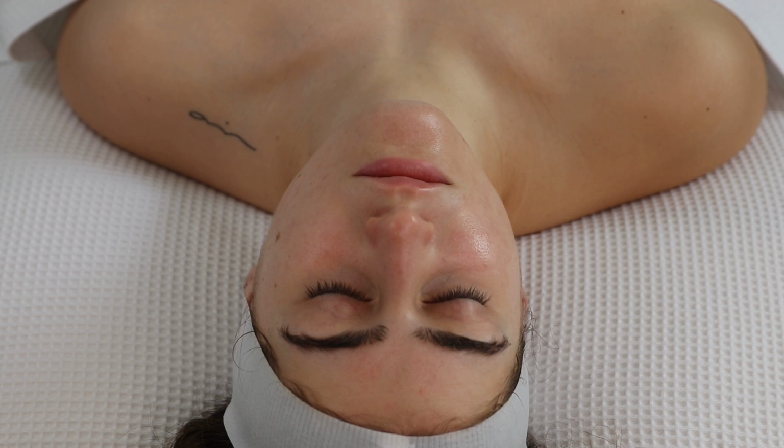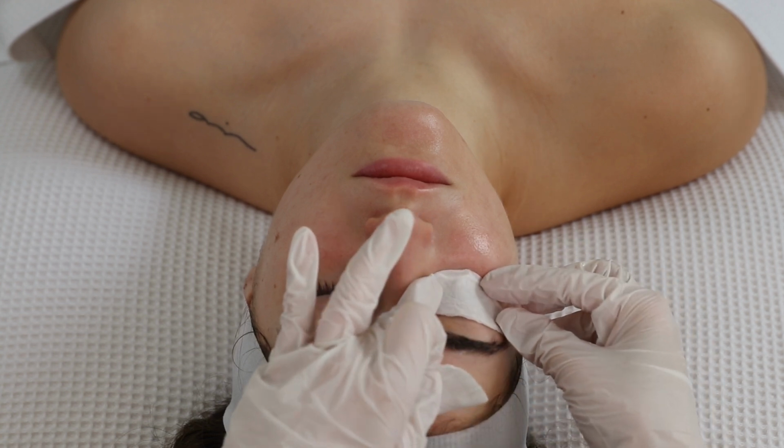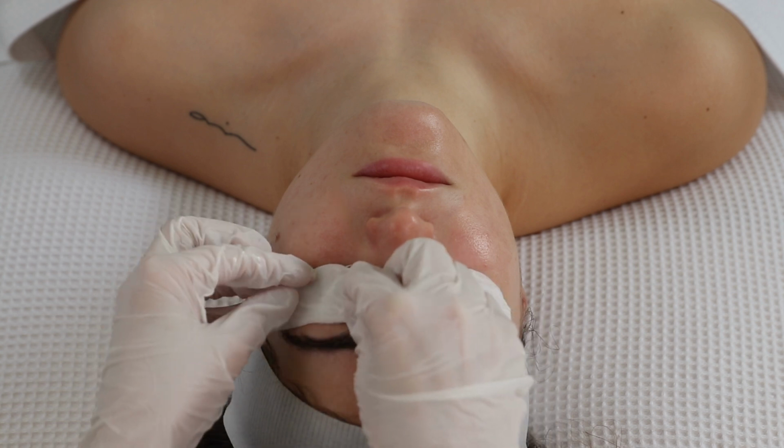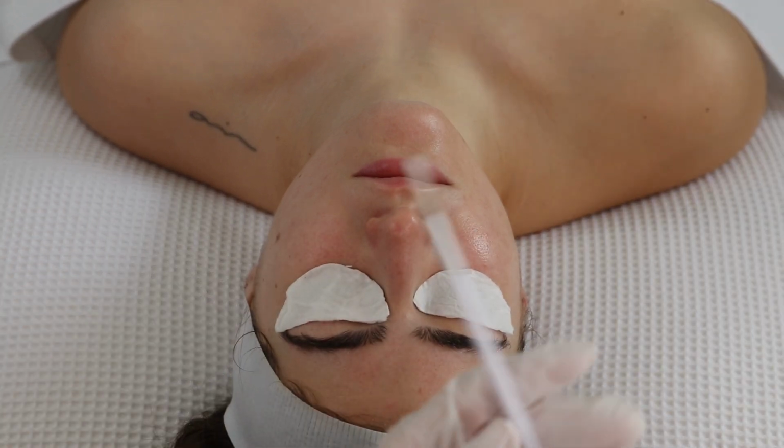Before applying the peel, always make sure that you cover the client's eyes, and for this you can use 2 damp halved cotton pads. This is a health and safety requirement for a chemical peel, so don't forget to cover the client's eyes before applying the chemical peel.